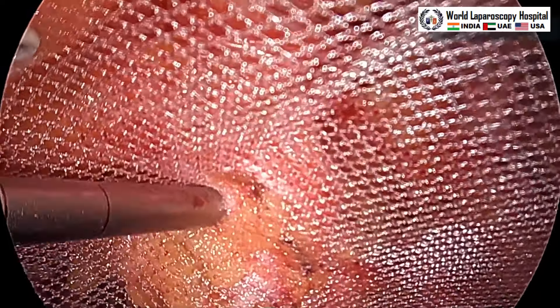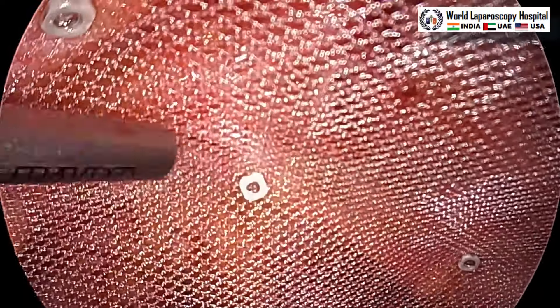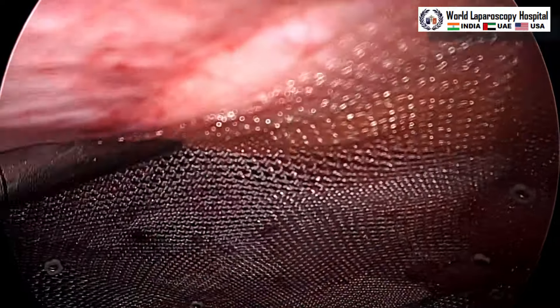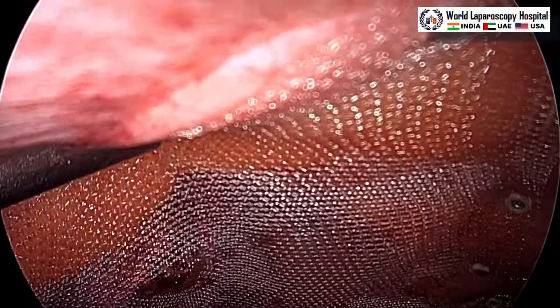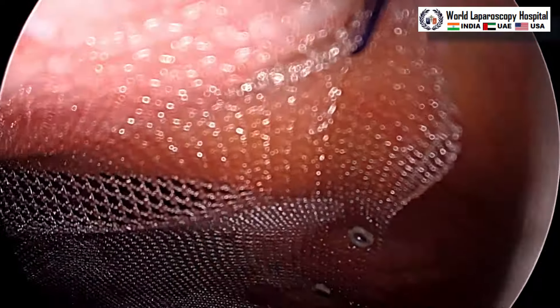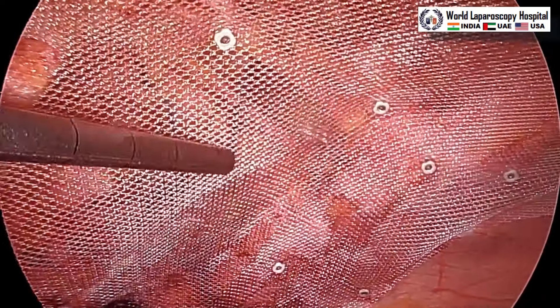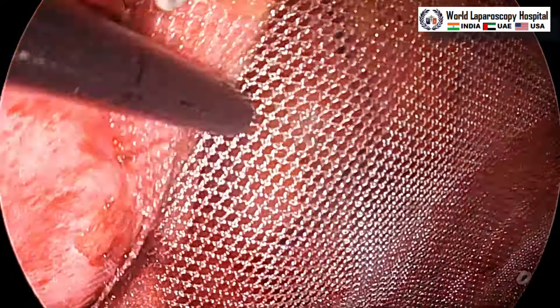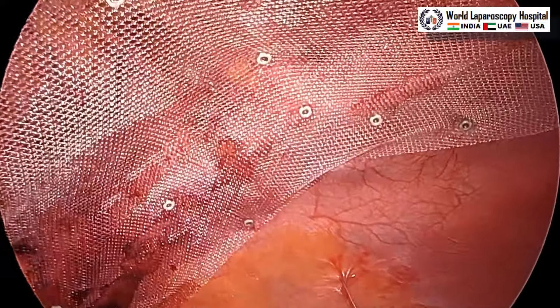This way you can perform the Swiss cheese pattern of incisional hernia repair. Surgery is over; now you will remove the ports and remove the gas. Thank you very much for watching this video. This was a case of incisional hernia where titanium mesh is used. The telescope is now withdrawn. Thank you very much and have a nice day.